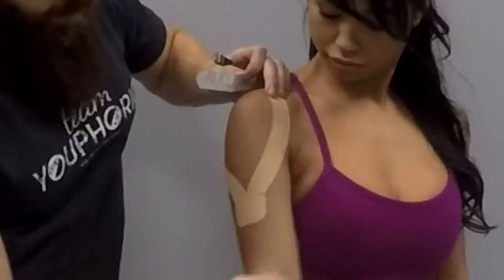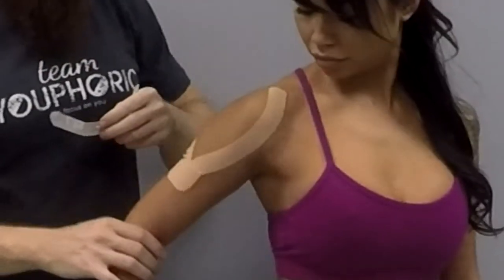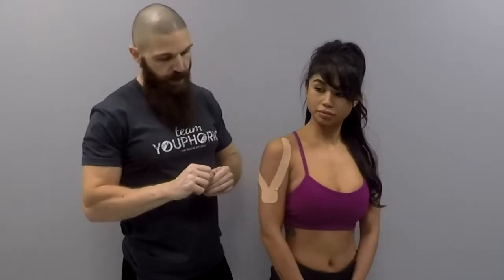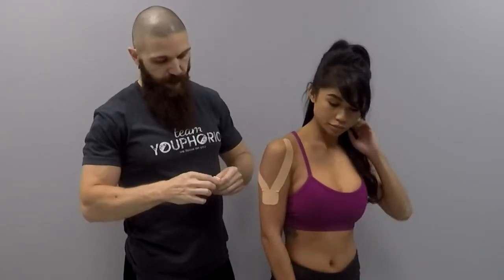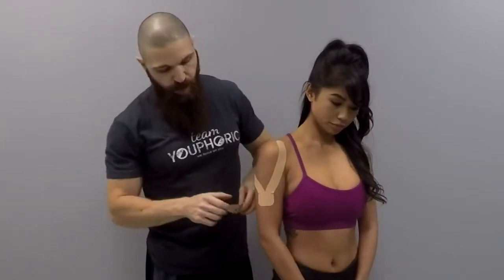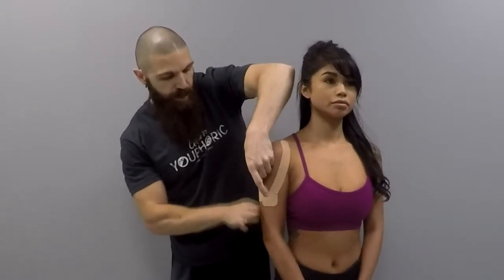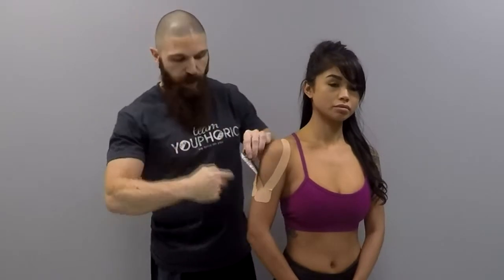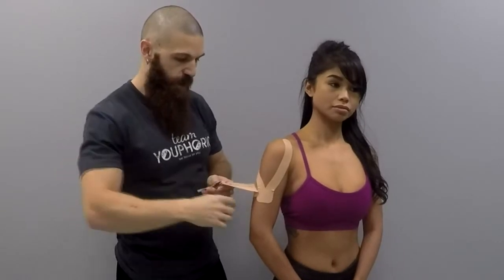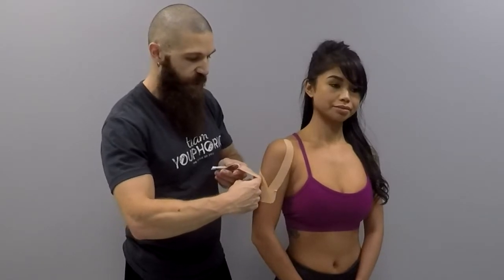Whenever they move their arm, there are going to be convolutions. So if you see convolutions when they move their arm, you know you did your job. Now, for the I-strip with the slit in the middle, just lateral to the Y-strip, you are going to apply your I-strip. Using your knuckle, put your knuckle inside of the little slit and create a little bit of a gap between the two.